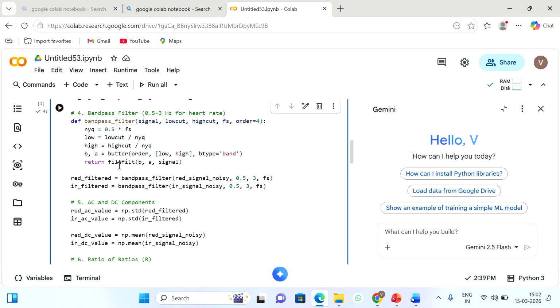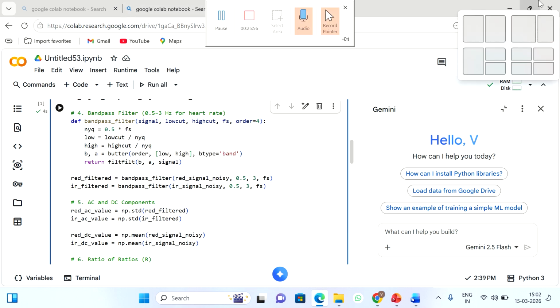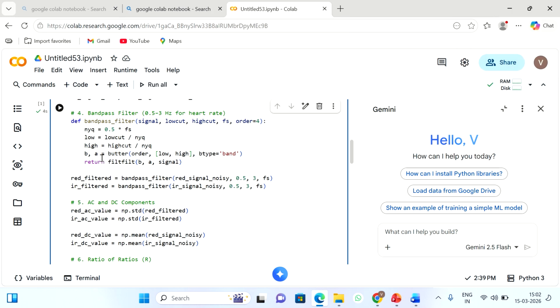And finally, it is returning the filter coefficients B, A. Why are we doing the filtering? There will not be any phase distortion or time delay. So we are getting a smooth, clean filtered signal. That is why we are applying the filter function.